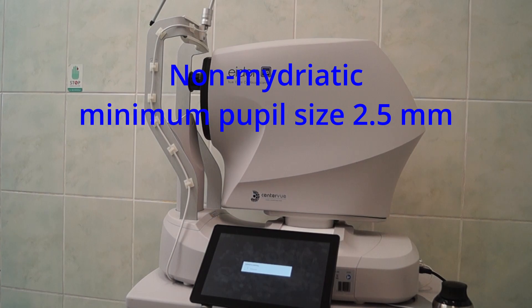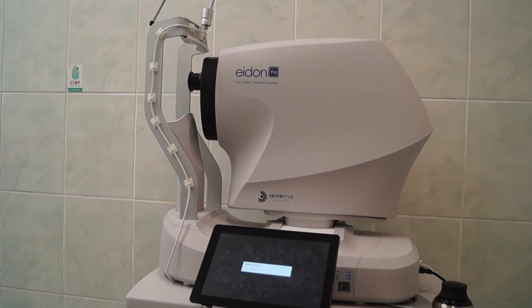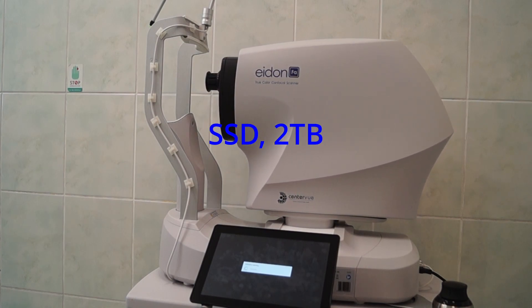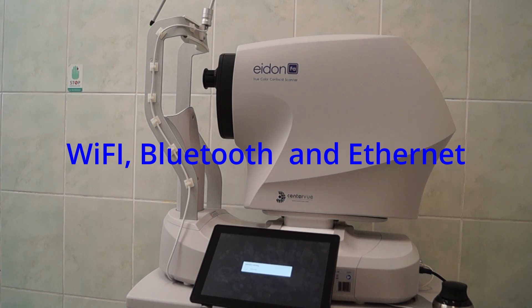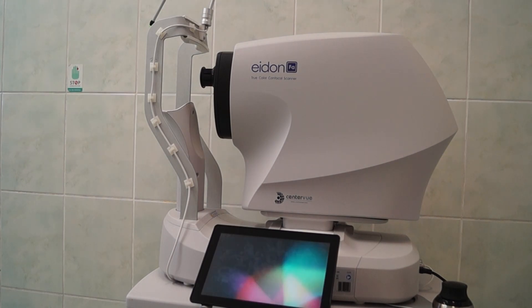So this is probably the only time a manufacturer is downgrading the ability of their instrument — it is possible to get 2.0. This device has 2 terabytes of SSD, and also has Wi-Fi, Bluetooth, and LAN connectivity. This particular device doesn't have DICOM, but there is an option to add the DICOM standard.